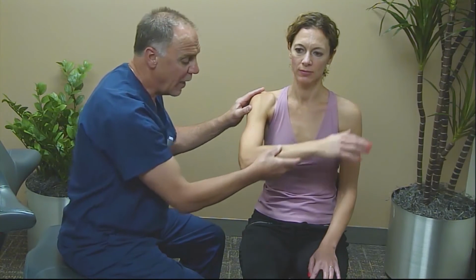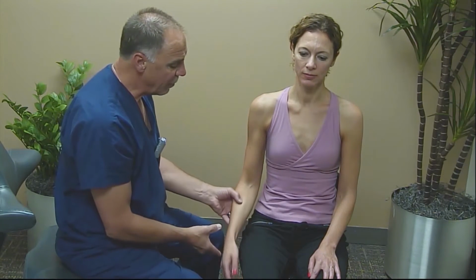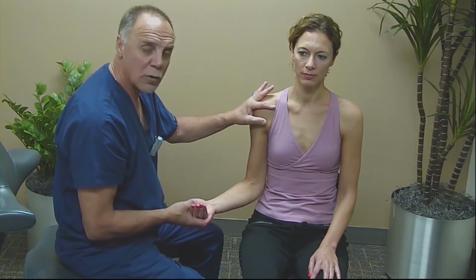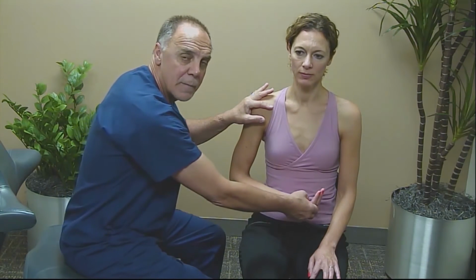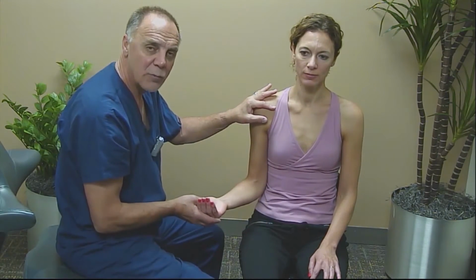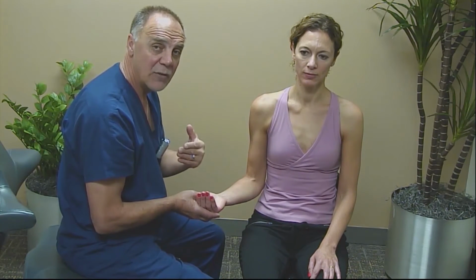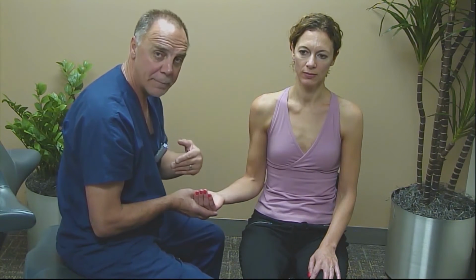The last thing that we like to do on the anterior part of the shoulder is looking for coracohumeral impingement, which means that we're going to have to get a long axis of the subscapularis, and then we're going to have the patient put their arm in external rotation, placing the transducer over the coracoid and the humeral head. We'll do a full internal rotation and external rotation 2 or 3 times to watch to see how well the subscapularis glides and the synchronicity of the subscapularis parts as they glide in and out of plane.